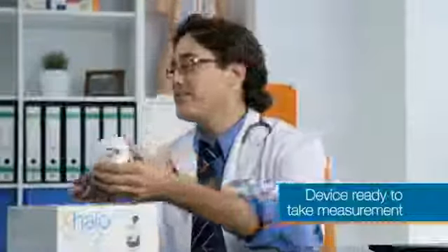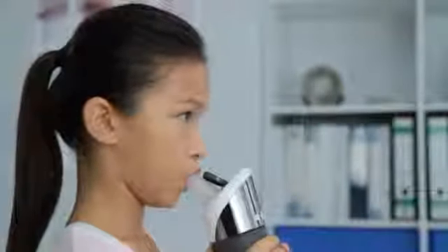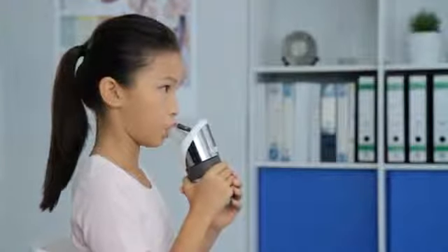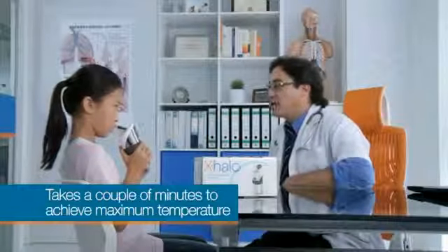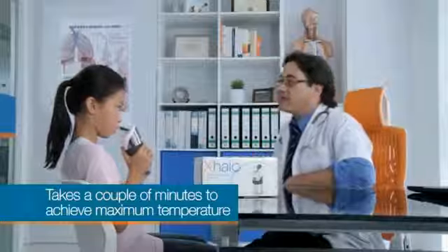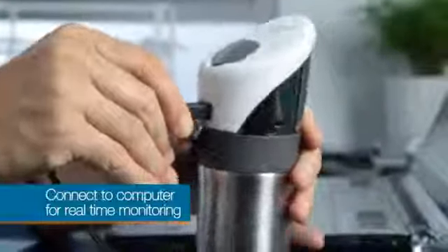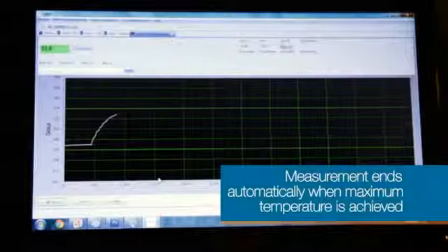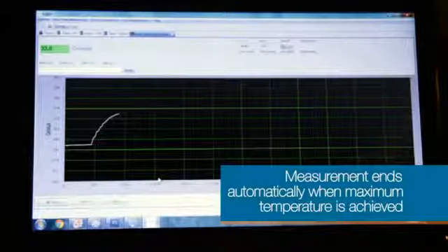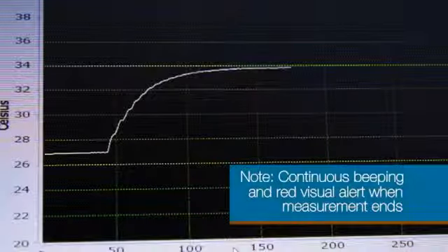The measurement can now begin. Make sure that the patient forms a seal around the mouthpiece with the lips and that she inhales nasally and exhales orally. It will take a couple of minutes for the device to recognize the maximum temperature of the patient's breath, which is equivalent to the temperature of the lungs. The device can even be connected to a computer via USB connection, enabling you to monitor the temperature in real time with the exhaler software. When the graph plateaus, that indicates that a maximum stable breath temperature has been achieved. The device will detect this and automatically end the measurement with audible and visual alerts.